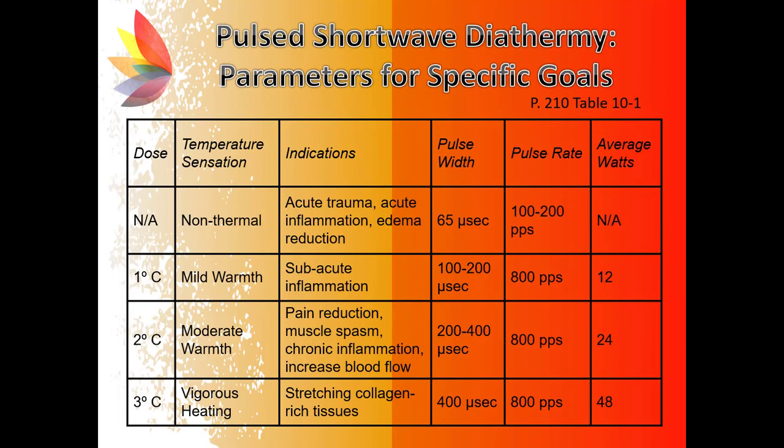This is a table that suggests the dosage parameters that are recommended for use with pulsed shortwave diathermy treatments. Please consult with this table for dosage, temperature sensations, and indications as well as setting parameters for different treatments. These treatments include non-thermal, mild warmth, moderate warmth, and vigorous heating.